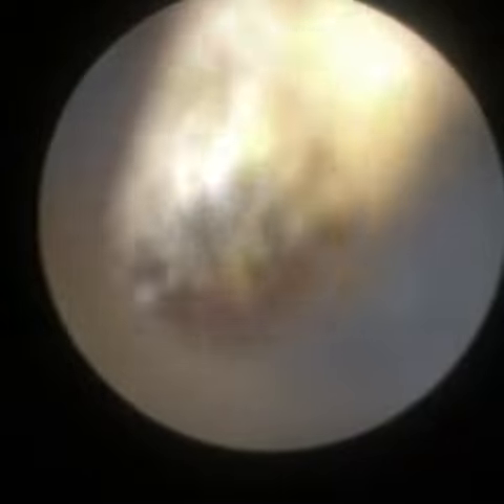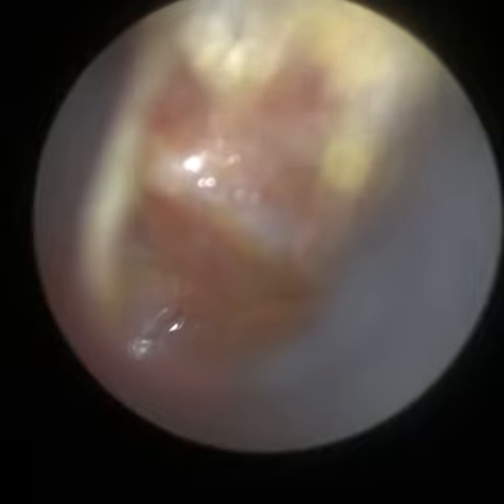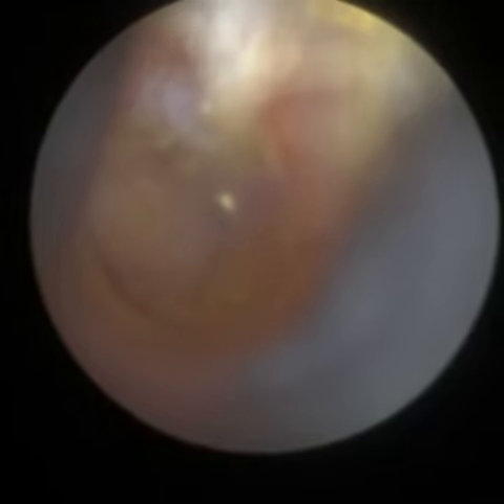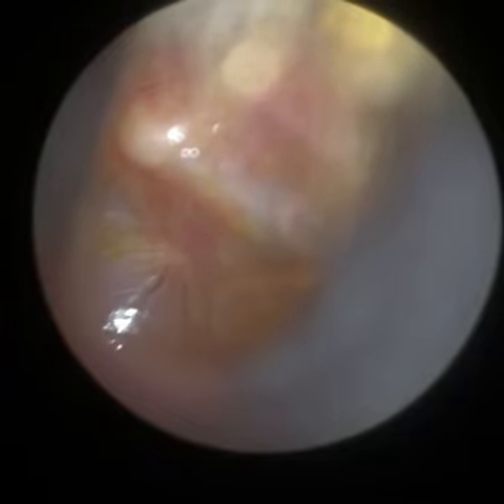And in a moment now we're going to re-enter the ear, and once more you can see I'm going to stretch the ear and straighten it. I'm actually going to just go in a bit further, because it's quite a bendy ear canal. I'm going to just stretch it a bit more, and you can see the full tympanic membrane now. I'm just going to get it in focus.